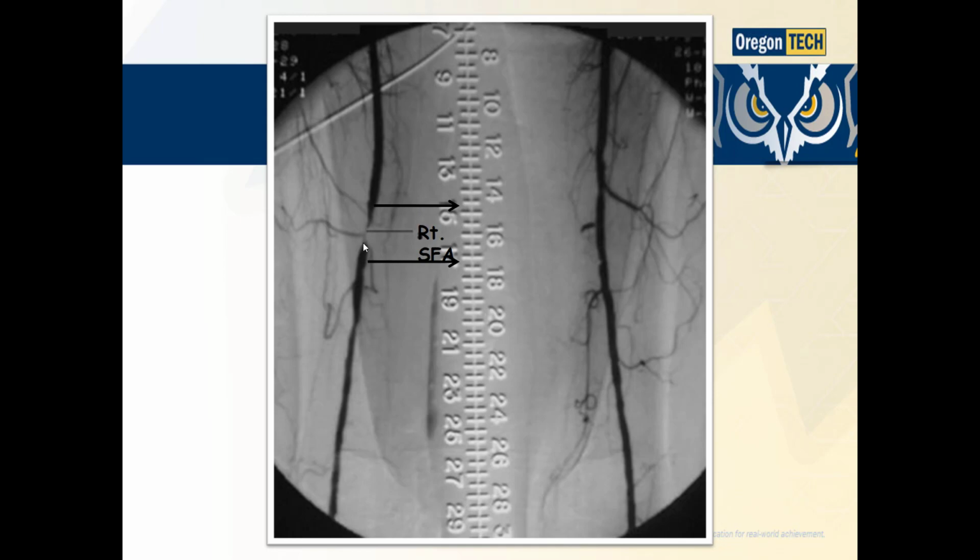Now you don't fix these right here and right here. What you want to do is go from healthy tissue, so this is about 15 centimeters here, and come down here to healthy tissue, and now we're at 17 centimeters, so we need a 20 millimeter stent for the length of it. And here you can see this side is reasonably healthy in comparison.